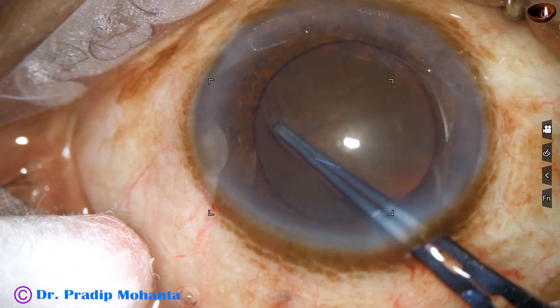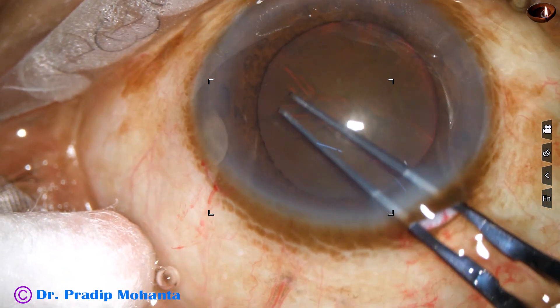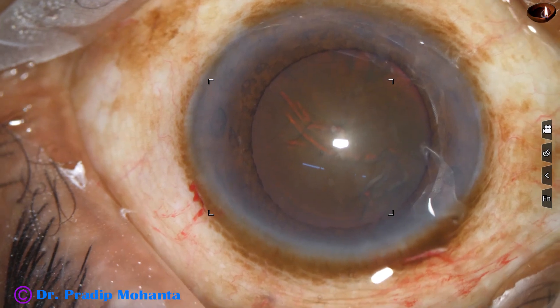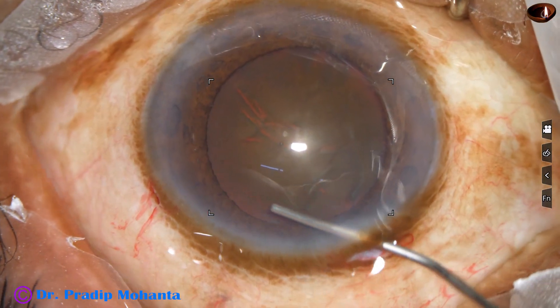Since this is a hard cataract, the size of the rhexis is deliberately more than 5.25 millimeters. In this case, it is about 5.5 millimeters.